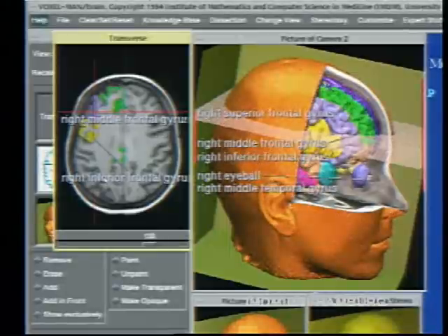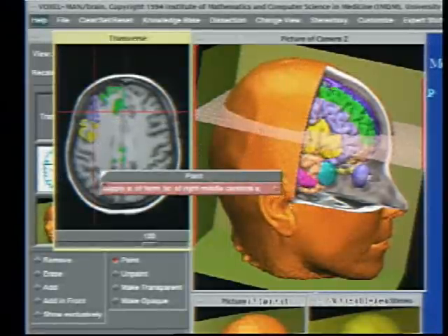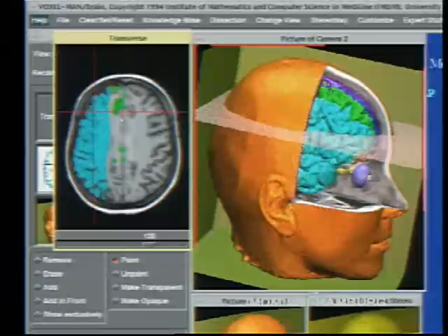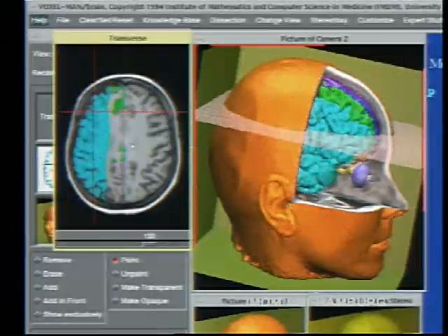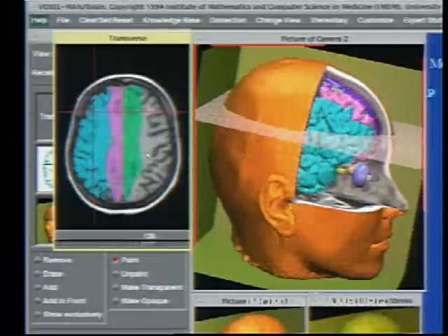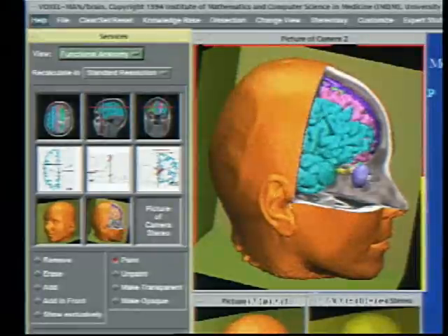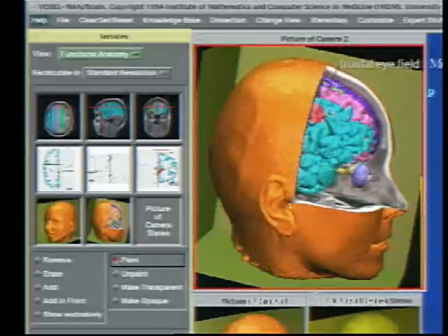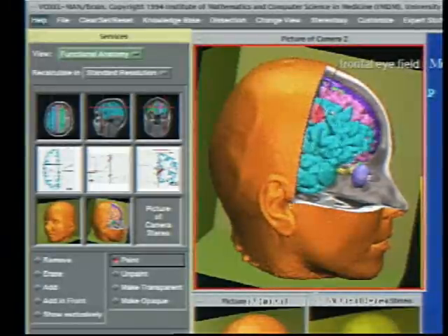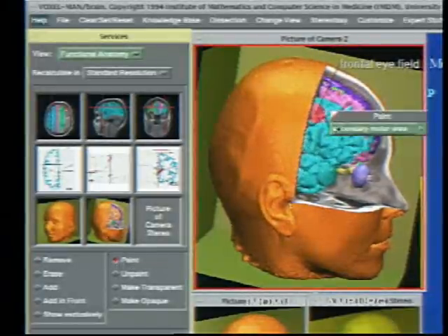Now the user is asking for the extent of blood supply areas of arteries. Both on the slice and on the perspective image, the regions of the right middle and right anterior cerebral artery are marked in blue and pink. Switching to functional anatomy, he can learn that the frontal eye field is supplied by the right middle cerebral artery, while the secondary motor area is supplied by both of them.